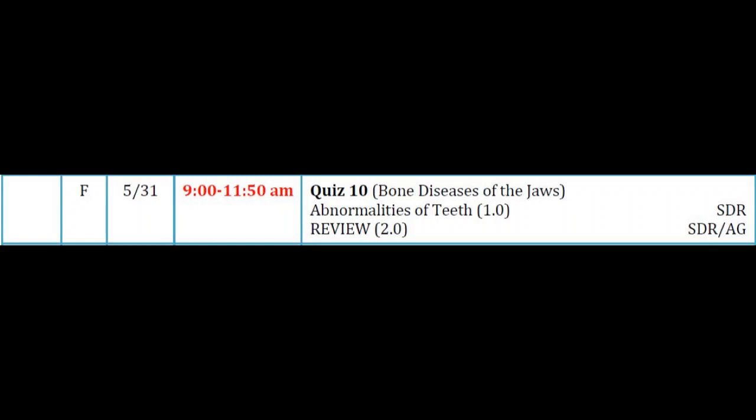And this is a patient who has an unusual pattern of multiple bicuspid teeth with dens invaginatus. And this one had to have a root canal already, and it affects some maxillary teeth as well. I don't know if you can see it, but it's there a little bit, and there a little bit as well. So sometimes it's posterior teeth, and sometimes it's multiple teeth in the same individual.